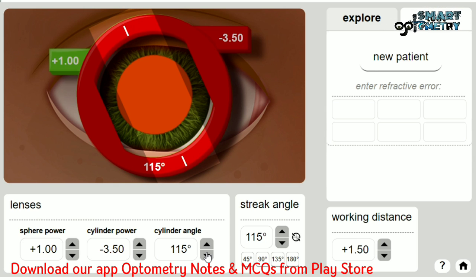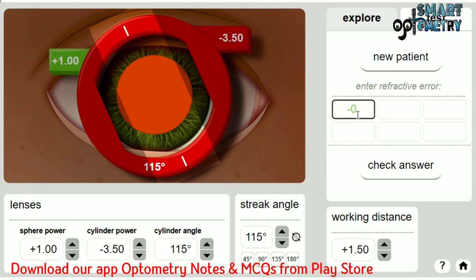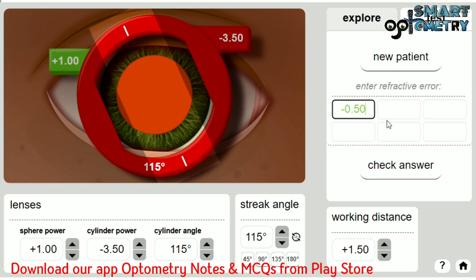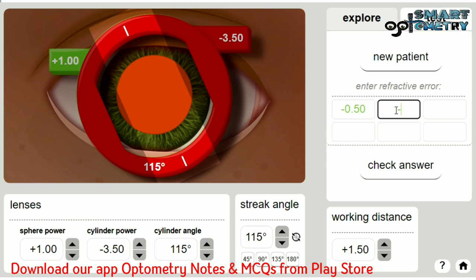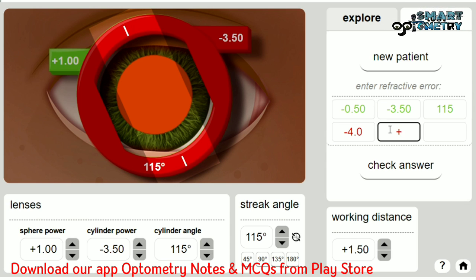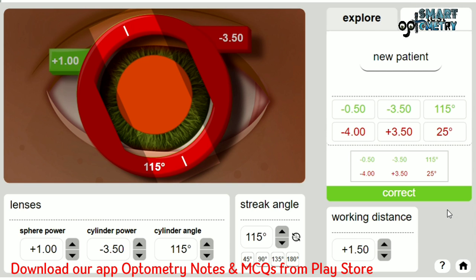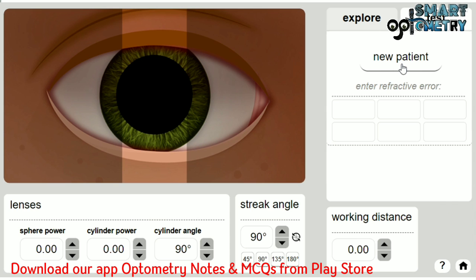After neutralizing the patient, type your results in minus cylinder form into the top box and in plus cylinder form into the bottom box. Then click 'Check Answers' to verify whether the power you got after neutralizing the patient is right or wrong. After finishing with this patient, you can get another patient by clicking the 'New Patient' button.